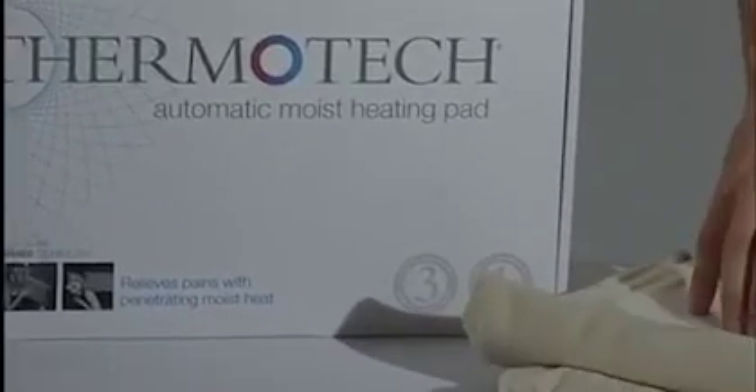Adam Averdeen here to talk to you about the Thermotech Automatic Moist Medical Grade Heating Pad with Infrared Technology. The Thermotech is a high heat, high intensity heating pad.